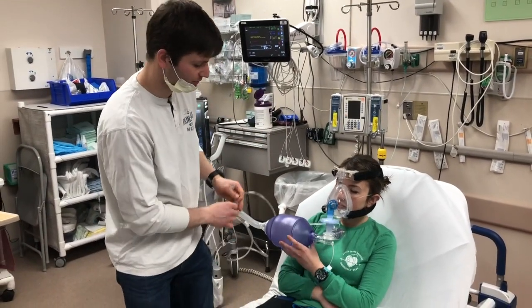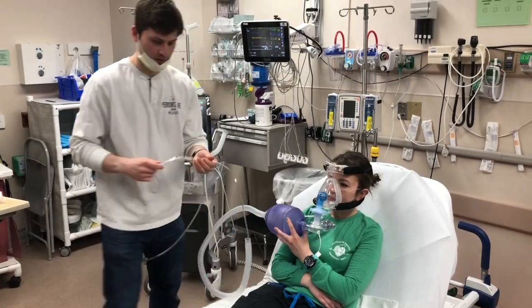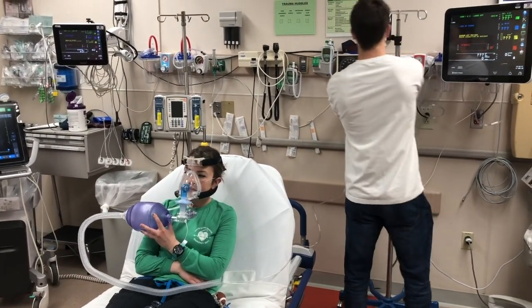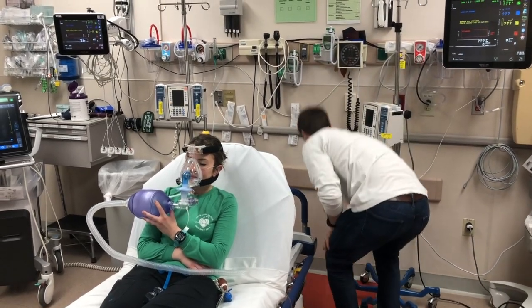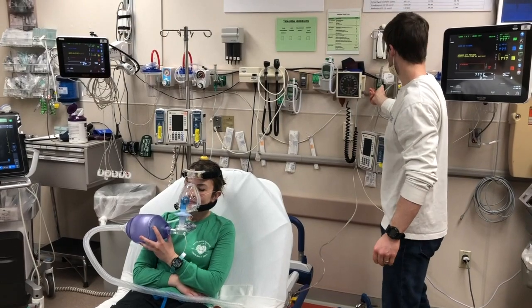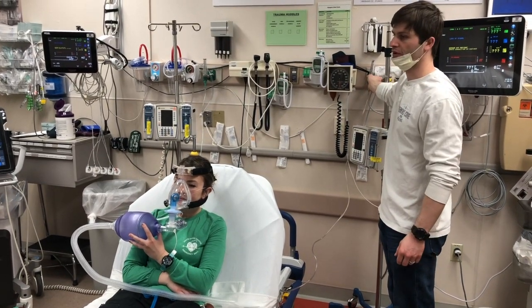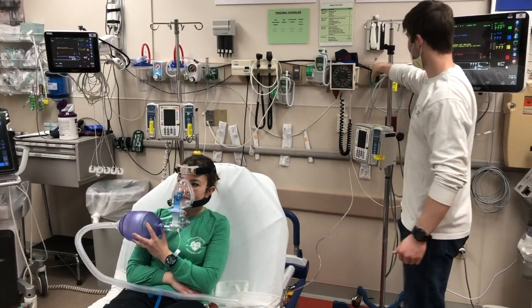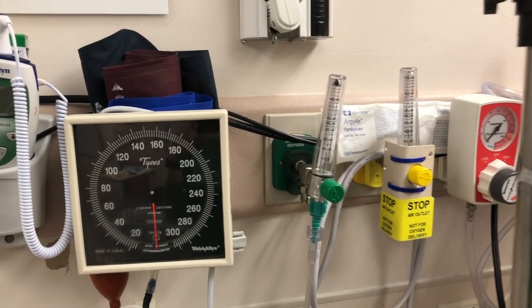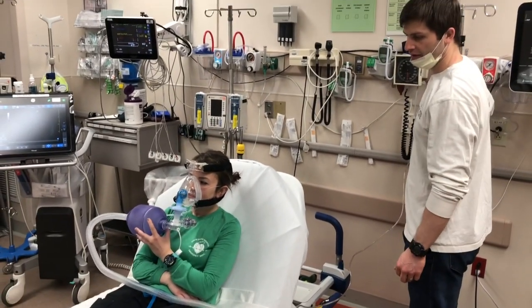We are not squeezing the BVM. Then we're going to hook this up to the wall oxygen. The nasal cannula is going to be on just 2, 3, 4, maybe 6 at most. But the BVM should go up to flush rate — bring it up to 15, then keep going until it stops turning or until you don't hear any excess oxygen coming in. Although these say 15 at the top, you can actually continue to turn it — some of these at various hospitals will go up to 60. So we want this cranked all the way to the top. This is our pre-oxygenation circuit, taking the place of anybody who needs a non-rebreather.